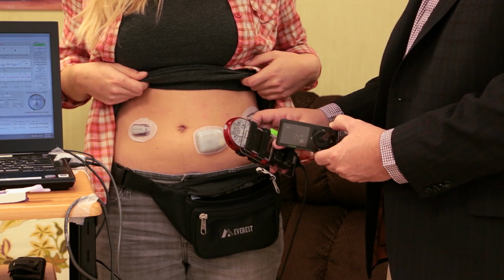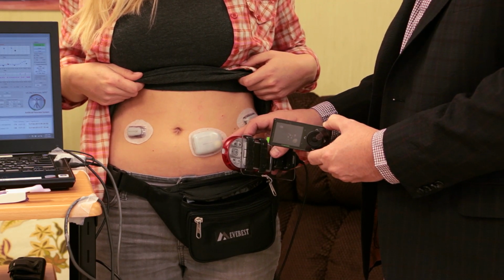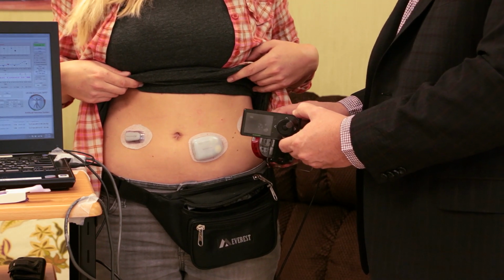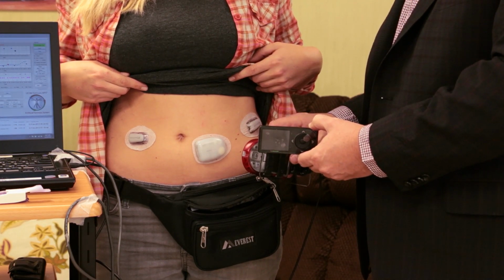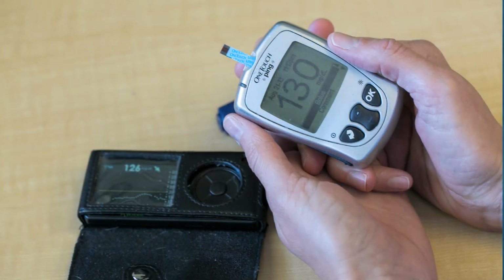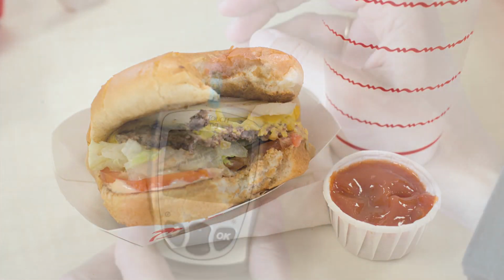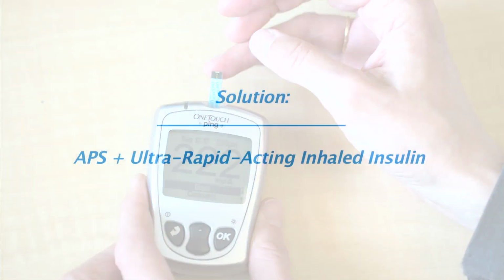which wirelessly communicates with the pod. The patient gets insulin every 5 minutes. And then we get another reading from the sensor, and it goes back through the same process over and over. Most of the problem with glucose control comes from meals. We talk about meals as a disturbance to the system. If there's a big disturbance, the blood sugar goes high, the system wants to give a lot of insulin, which may put them at risk for going low later.